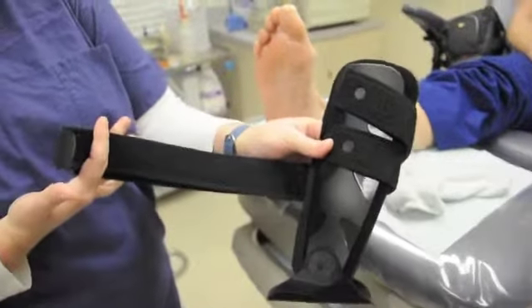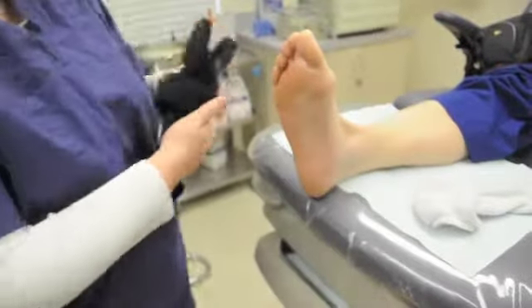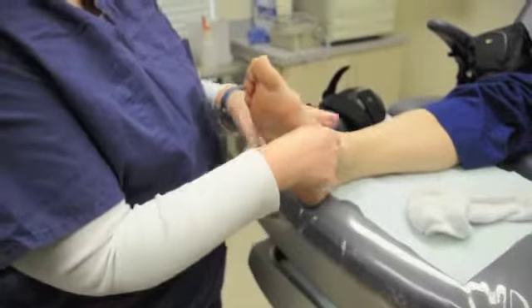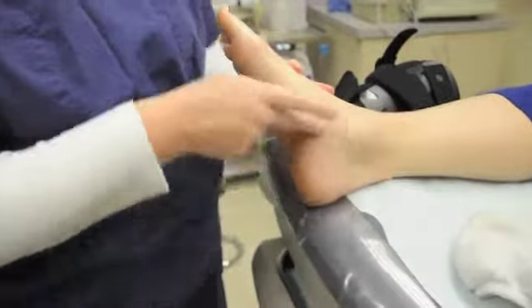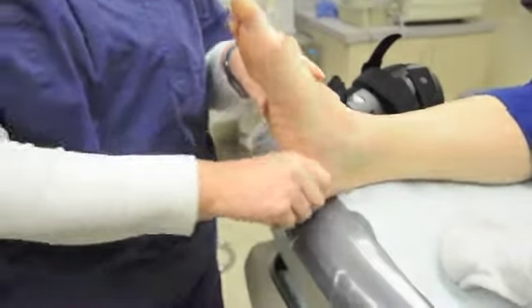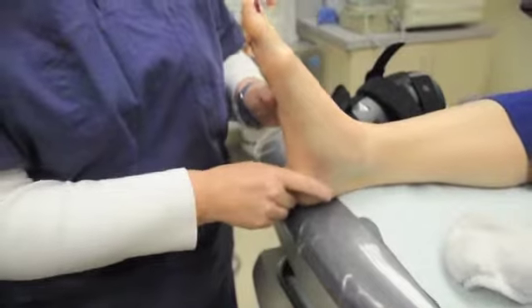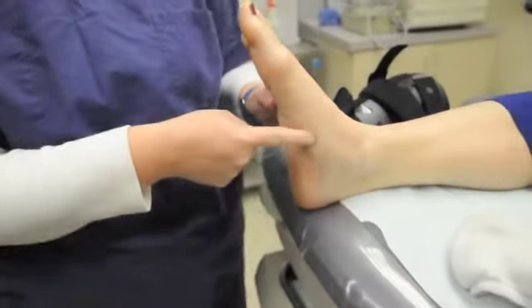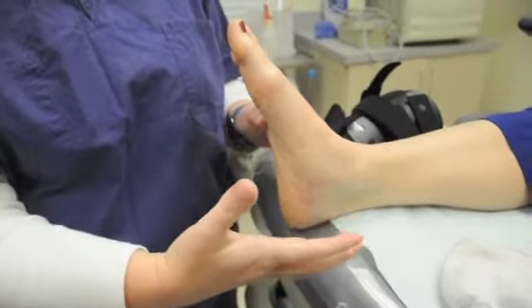This is a stirrup ankle brace. It is used for patients that have ankle pain or posterior tibial tendon pain, which is the long tendon that comes across the inside of the ankle. Patients that have incredibly flat feet, like Penny is a great example, when they walk they have a tendency to walk over like this and they really overstretch that tendon. It bulks out, gets really swollen, and it hurts. It is really painful.